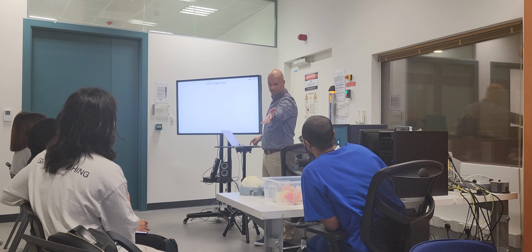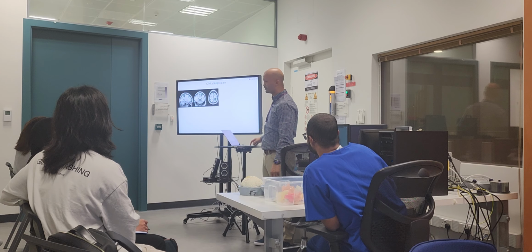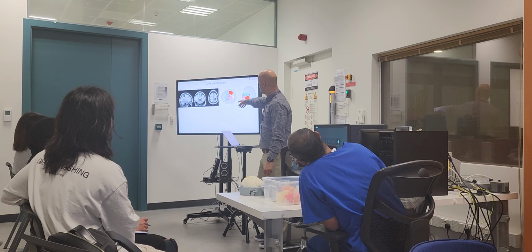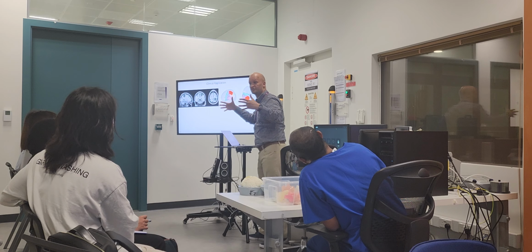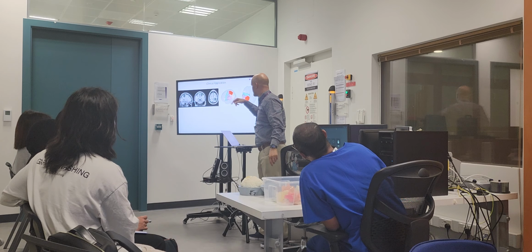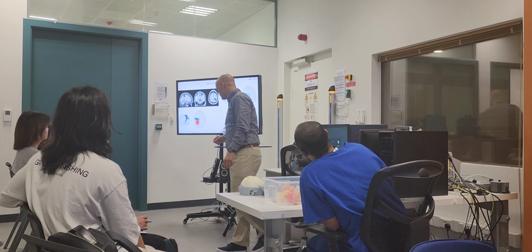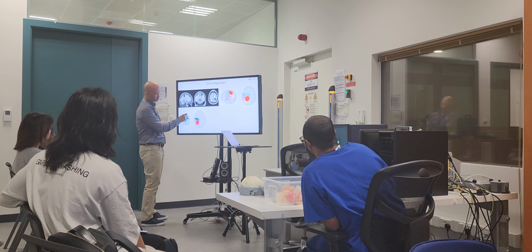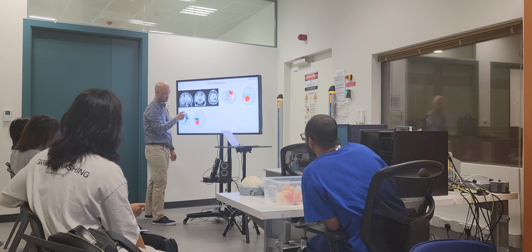Clinical application. Our colleague here shows up at Cleveland Clinic. The surgeon calls me: your colleague has a brain tumor. So we scanned her at Cleveland, did the brain segmentation, and here's her tumor. We're interested in structure. Now you're seeing an application of this multimodal structure and function: motor cortex, sensory cortex, some language areas. This is the lateral view, this is the top view. These are the highways. See this bundle here? This is the motor bundle. It connects her motor cortex to the spinal cord.